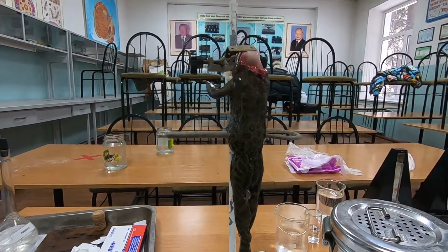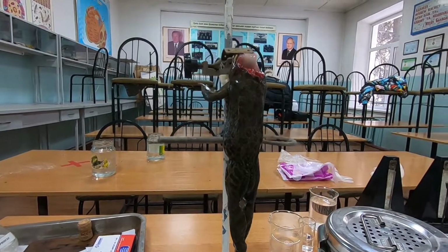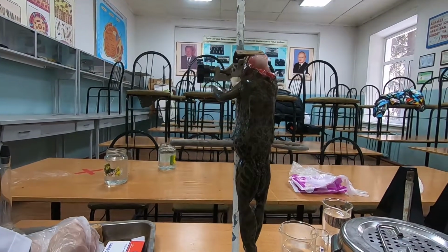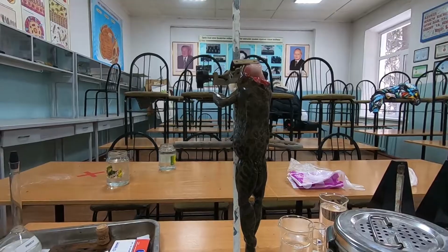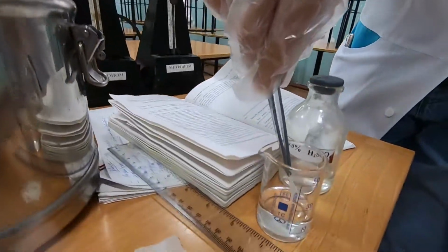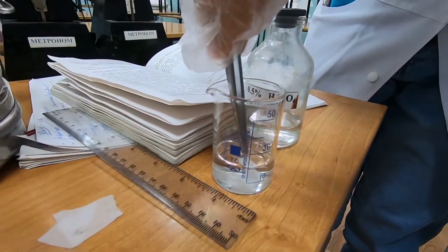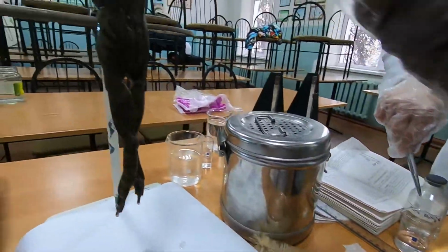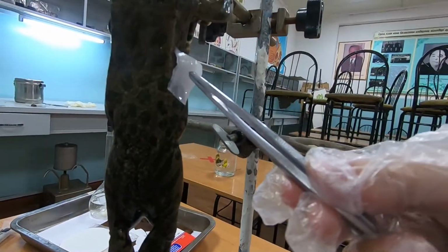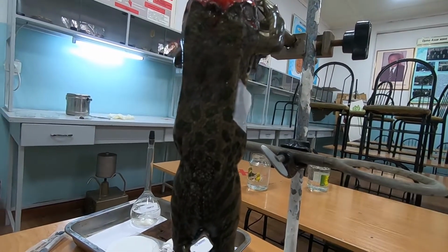And then we leave it for a few minutes. After a few minutes, we're going to apply it at the side. Please, take one again. Yes, the bigger one. Yes, bring it. Dip it there. Put it on the side here. Okay.